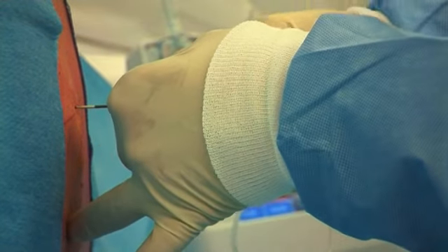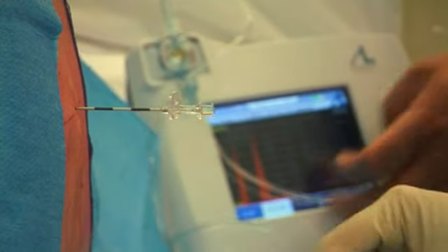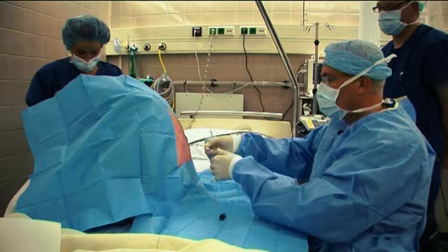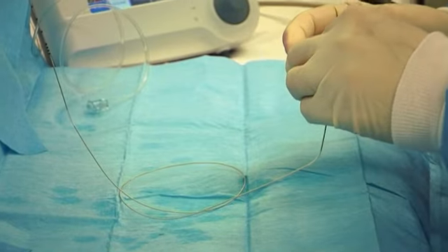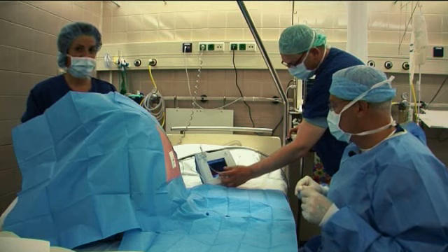As soon as the epidural space has been reached, the anaesthetist detaches the disposable from the needle and places the epidural catheter. The anaesthetist then attaches the disposable to the catheter and restarts the pump.